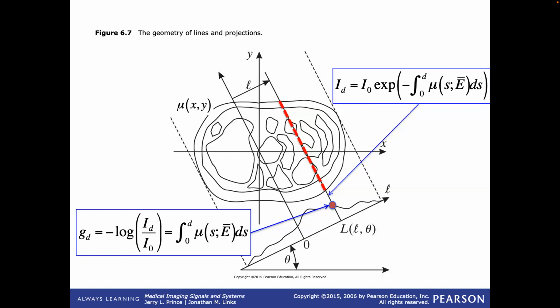Correct. Yeah, correct. So in a sense, I just have a big table of intensities that I've measured when I go through all these settings at that detector position, right? And so that detector position and angle will be associated with a collection in a patient later. And I know if there was no patient there, what I naught would have been measured as, right? And so you normalize to that.